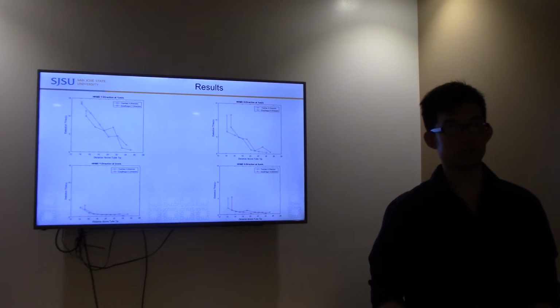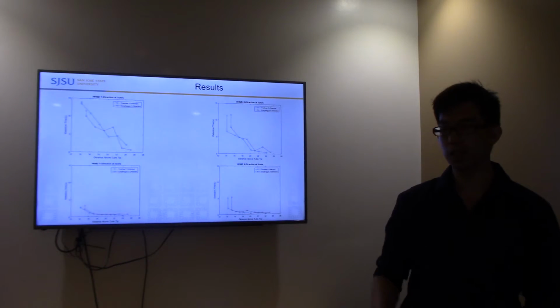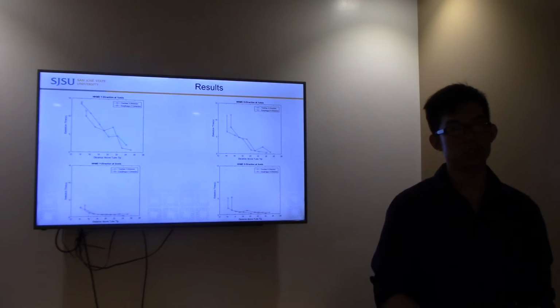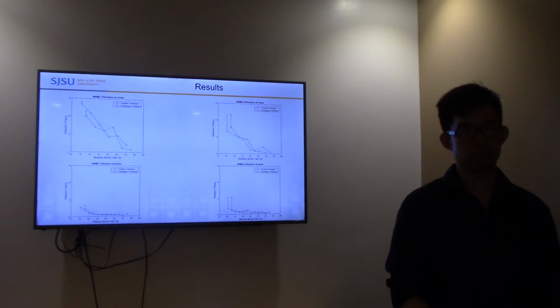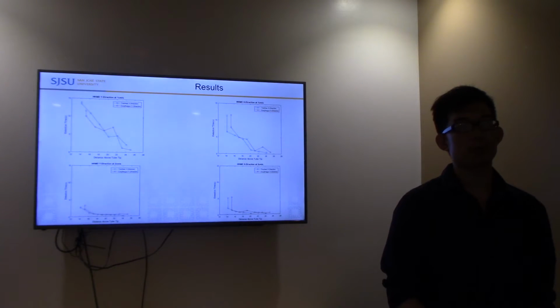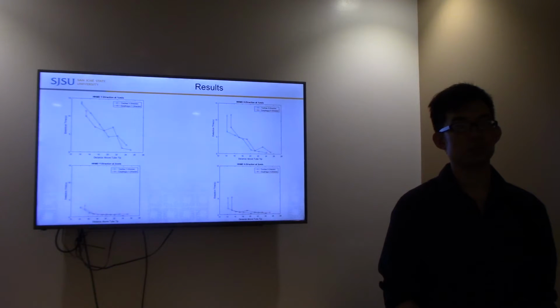Did you know the rate of your conveyor belt? Yeah, it's 1 centimeter per second for one speed, and the second one is 2 centimeters per second. So I'm just comparing the two different speeds. Okay, so in theory, if you convert your speed into distance, you should be getting the same information, right? Did you do that? Are they consistent? Does the speed matter in the end?